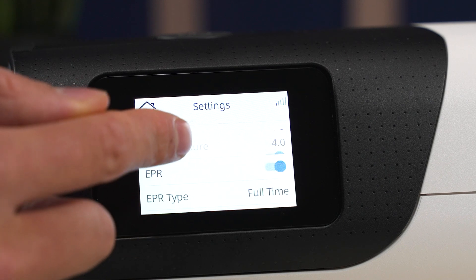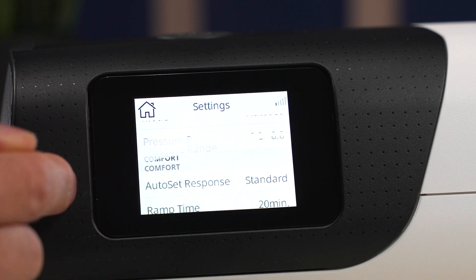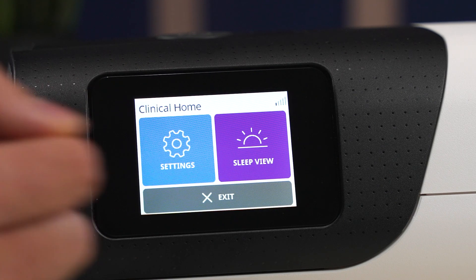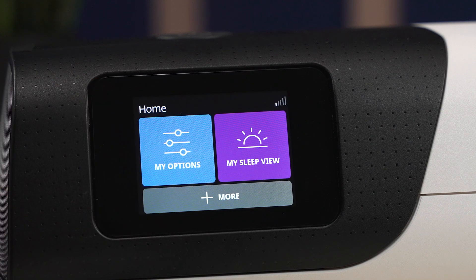We're just going to leave it like that, click the home menu, click exit, and there you go. You have changed the pressure of your CPAP machine.